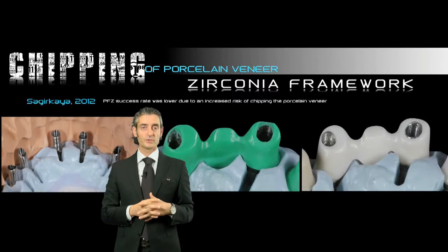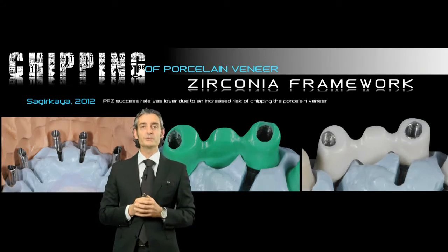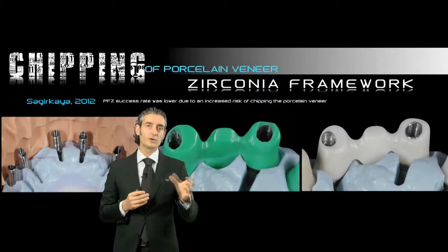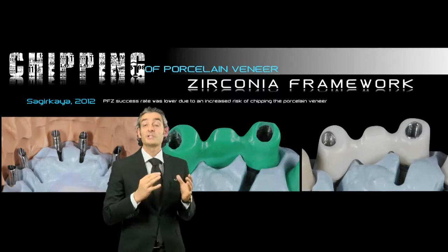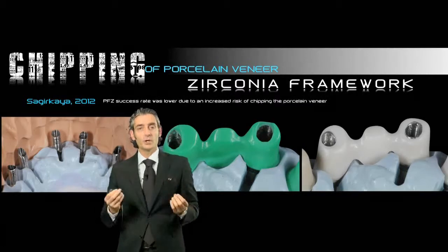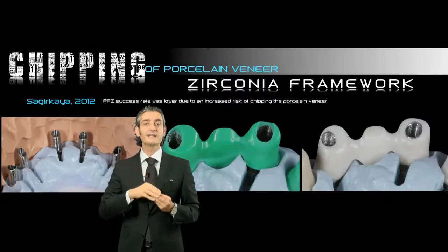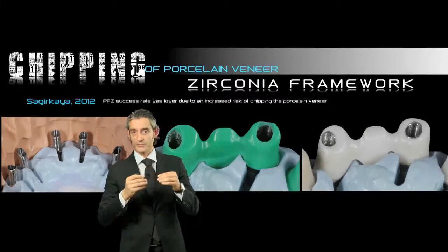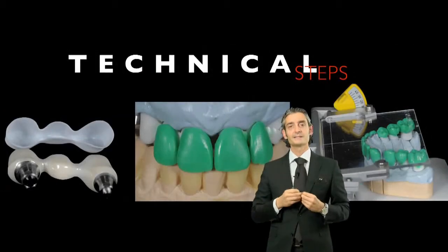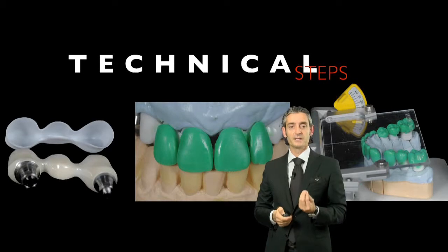And so right now, for the final restoration, our worry was about what kind of material we can use. Remember that every single time you go for a full mouth rehabilitation on implants, we are worried about chipping, for example. So our idea was to create a zirconia framework and to cement over it a monolithic lithium disilicate crown. And so we created this kind of framework, really not a supporting framework, only this line of zirconia over which we are going to create the shape of the final crown.